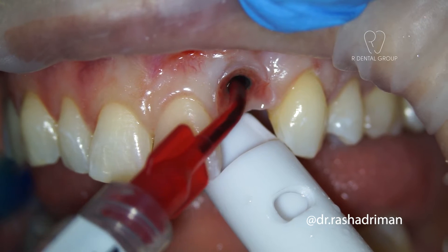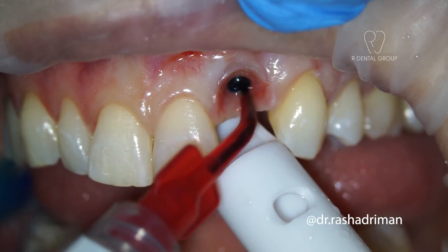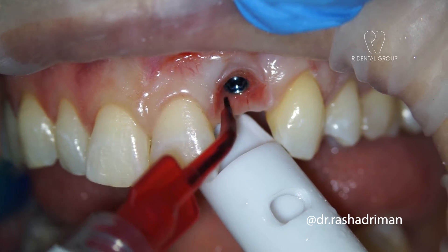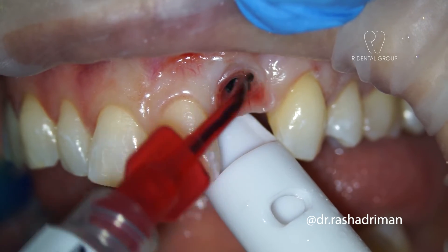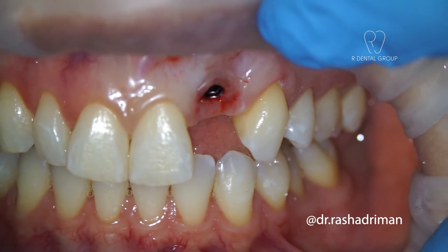I went ahead and cleaned the area with 4% chlorohexidine to make sure there's no debris and it's clean before I connect my impression coping. I do that gently to not cause bleeding. You can tell the tissue looks pretty healthy.